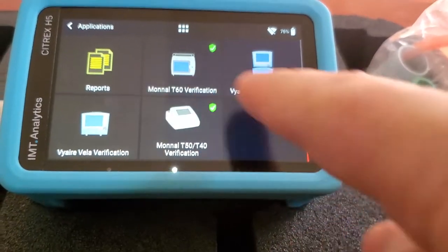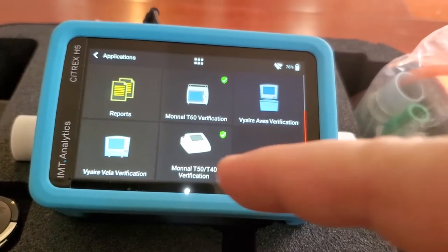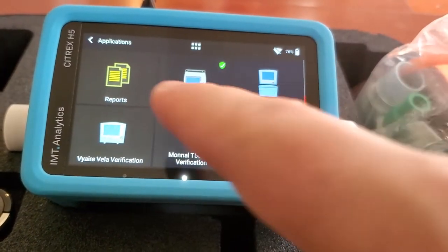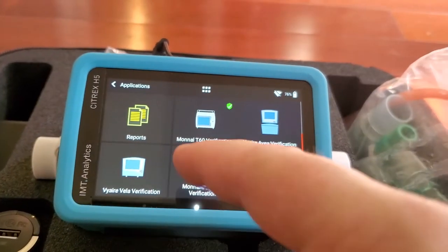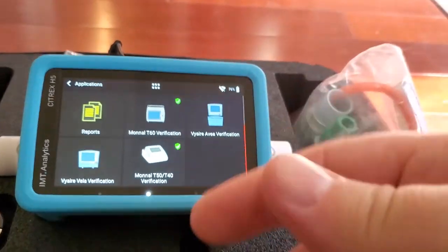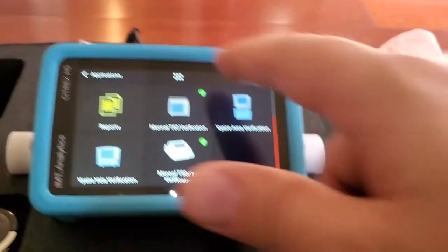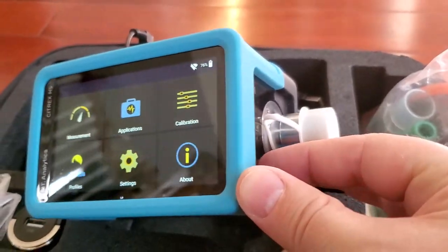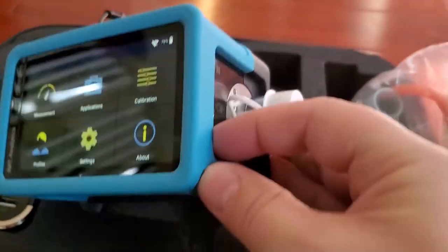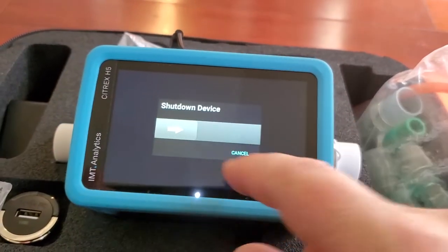Applications — oh, very nice! There are different ventilators preloaded. I've heard about that — you can preload different ventilators, that's cool. And there are also reports, so that's one of the cool things about this device: you can export everything you did during the PM into a report, attach it to your work order, and you're good to go. I just had to power it up and get a look at it because this thing is just so cool.